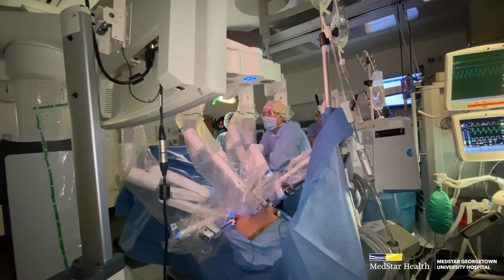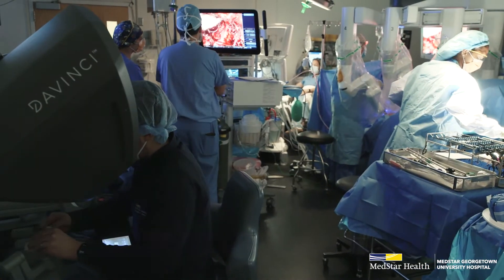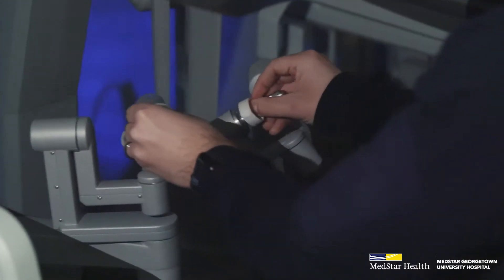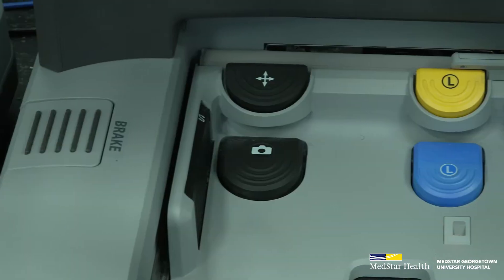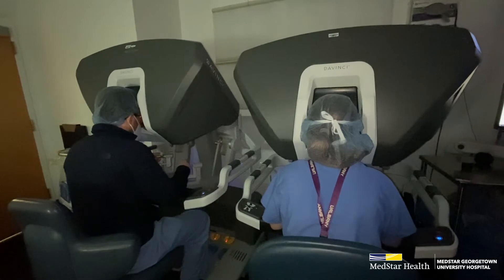Retzius-sparing prostatectomy is a newer form of robotic prostatectomy. Each surgery probably takes about two or three hours. There are about six small incisions across the abdomen in an upside-down U shape, where we can put the instruments through. The robot is attached to these ports, and that is how we are able to control the movement of the instruments.